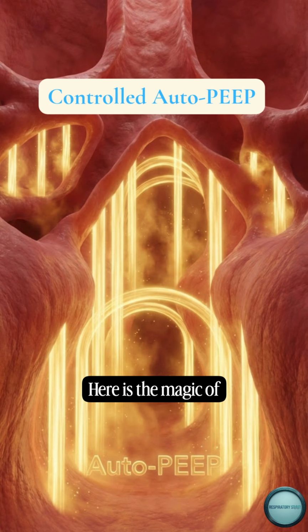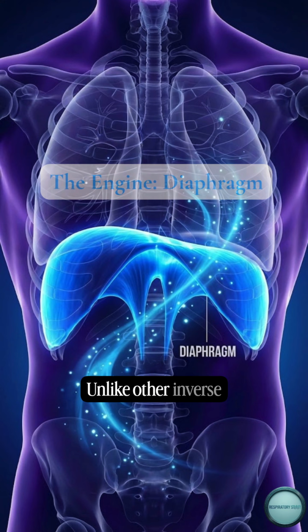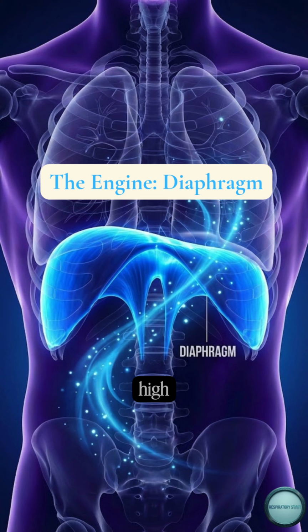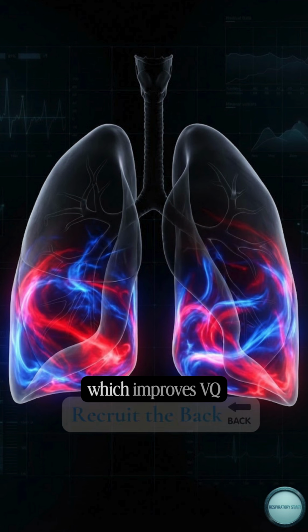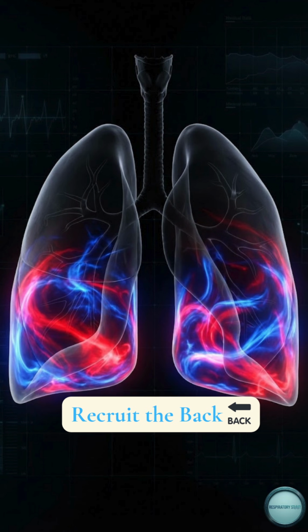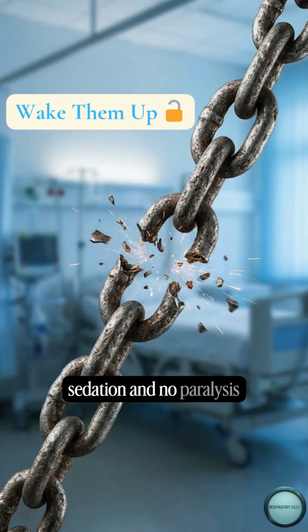Here is the magic of APRV. Unlike other inverse ratio modes, the patient can breathe spontaneously at any time. They can breathe on top of the P high. This moves the diaphragm, which improves VQ matching to the dependent lung zones. It requires less sedation and no paralysis. A moving diaphragm is a happy diaphragm.